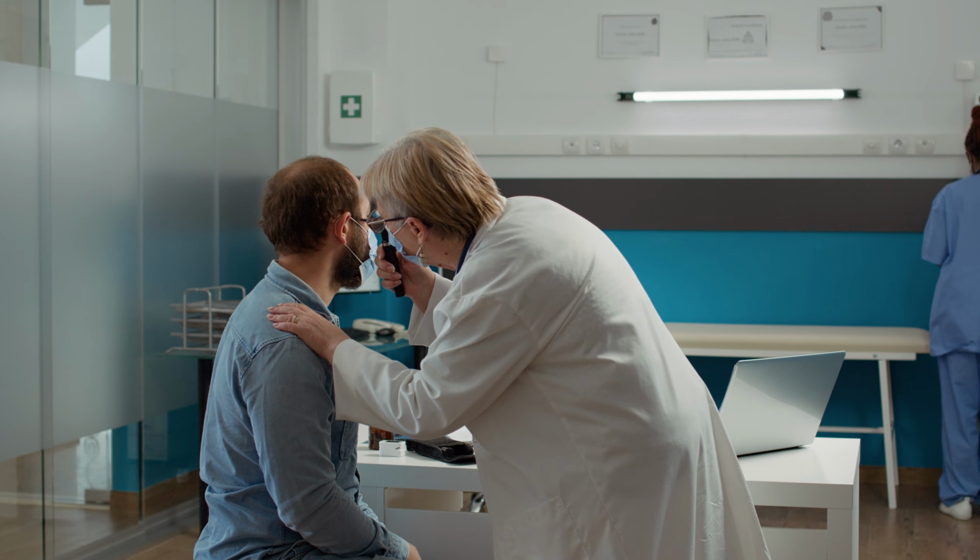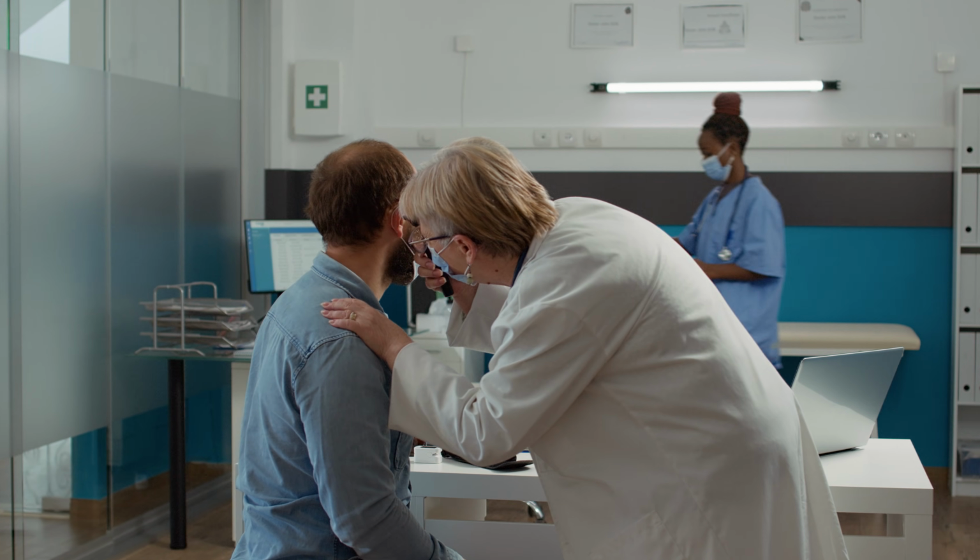The surgery is more complex to implant this particular type of cochlear implant, but I have faith that pretty much every neuro-otologist would be able to learn this new method without too many issues. The programming of the Acclaim cochlear implant, on the other hand, is relatively complex at this point, and there just isn't enough patients who have been fit with it to determine how it should be programmed for optimal hearing ability. However, as more people are implanted, I do expect them to get significantly better at this in the future.